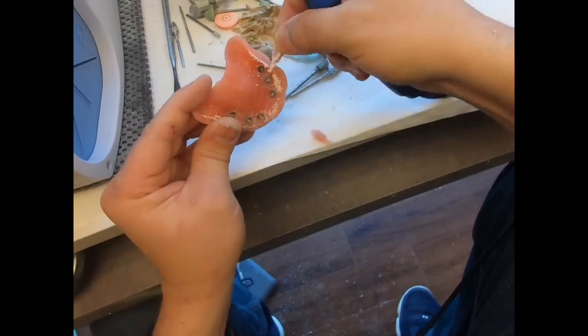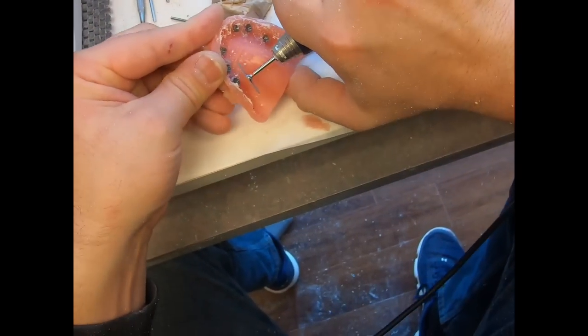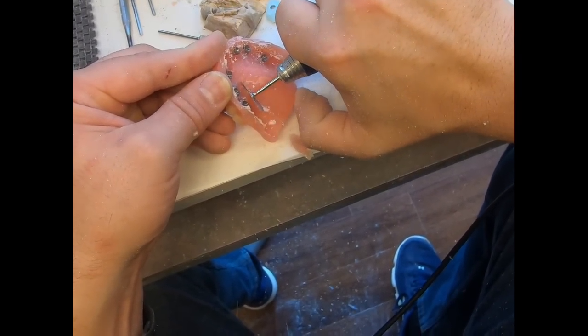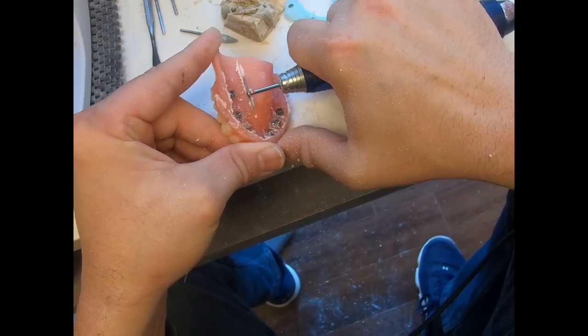Then we just relieve and remove some of the cool dam that was stuck in the denture, and then we're going to cut the flanges off. Then we're also going to cut the palate out, and then we'll start with our bulk reduction with an acrylic burr.